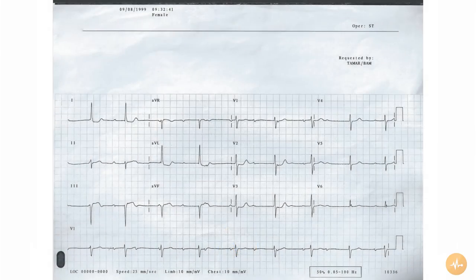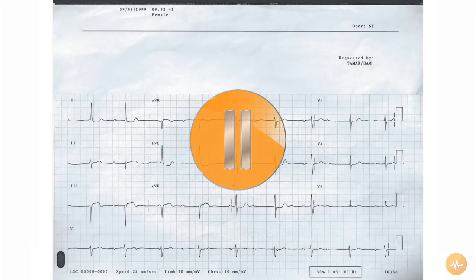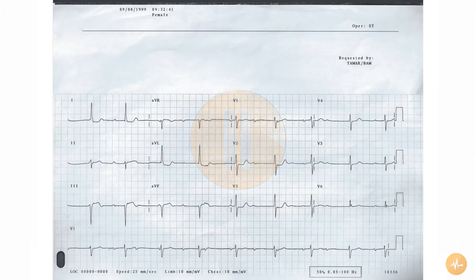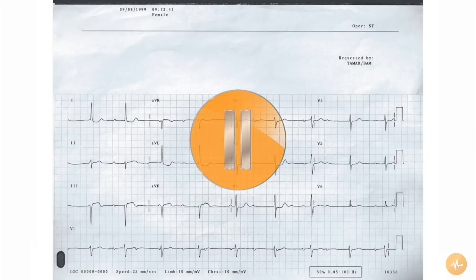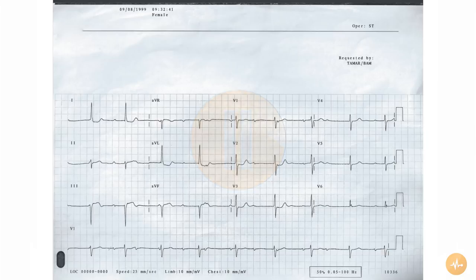This is a 12-lead ECG recorded from a middle-aged female complaining of chest pain. The rhythm strip is unusually recorded from lead V1. Pause this recording now and interpret the ECG on your own before pressing play again to hear me interpret the ECG.